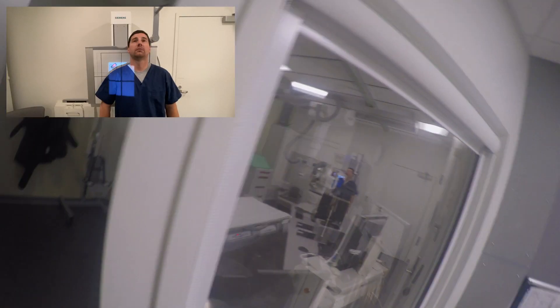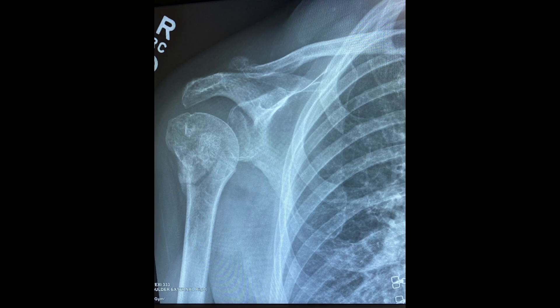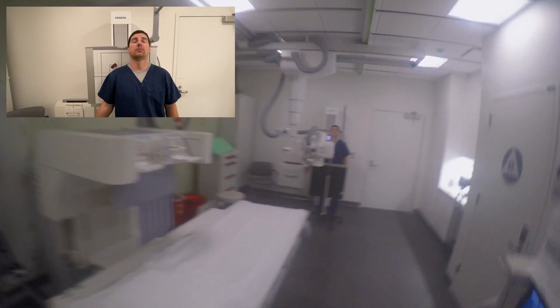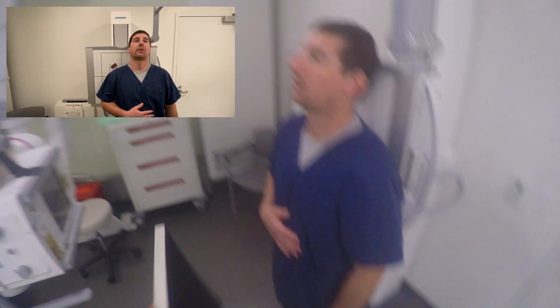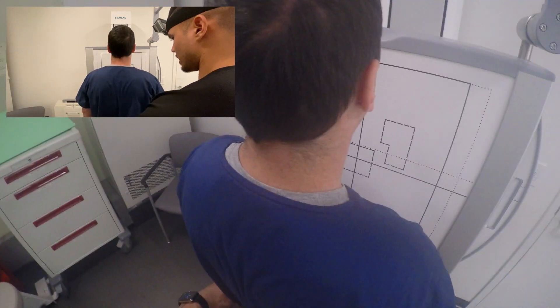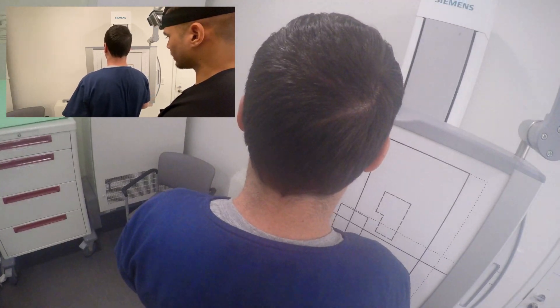Go ahead and rotate your palm forward. Now go ahead and put your hand on your stomach. And then we're going to turn around and face the board. And then we're going to rotate you a little bit more. Move your feet with you. There you go. I'm going to slide you over to your left. Move your feet with you as well. There you go.